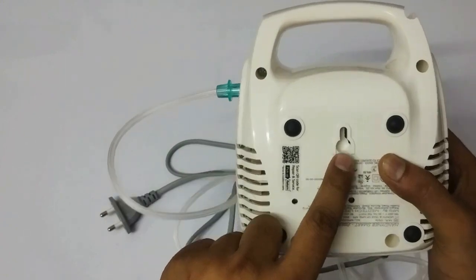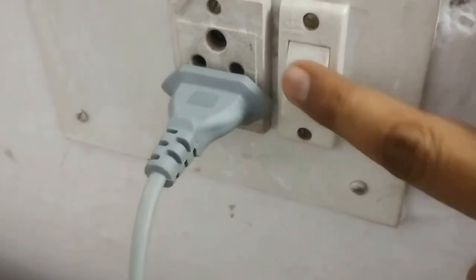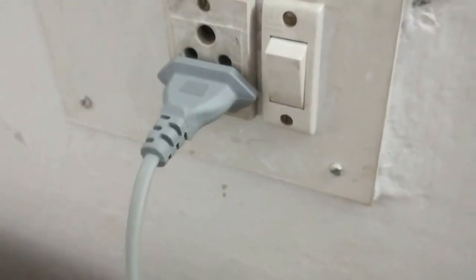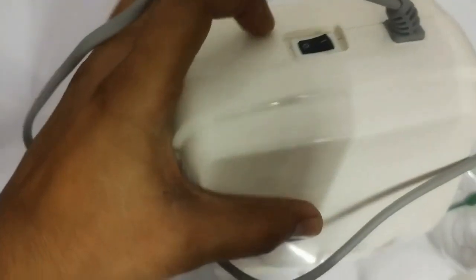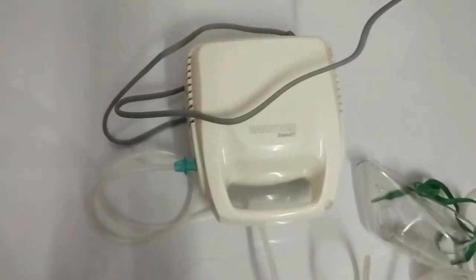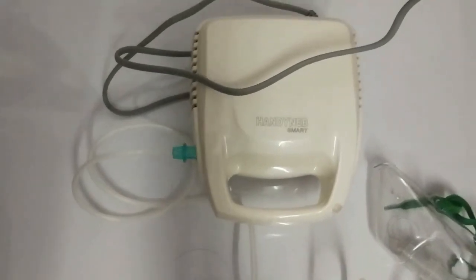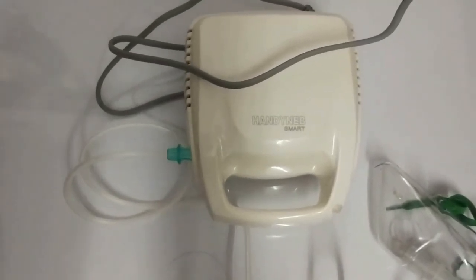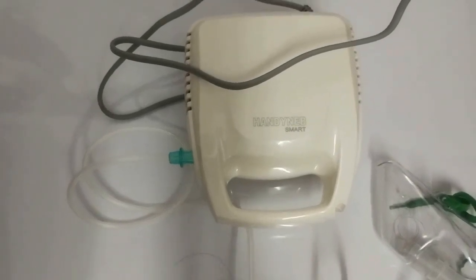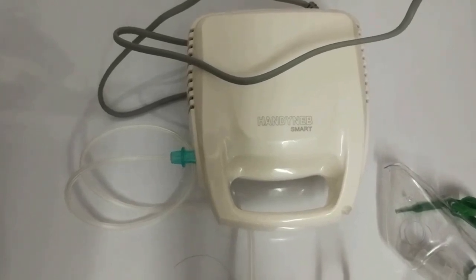I've just connected it to the plug. Switch on the device using the on/off button on the back, and you can hear the sound. The nebulizer machine helps provide medication directly to your lungs. This device is designed to convert saline water and medication of different viscosities into a fine aerosol mist.